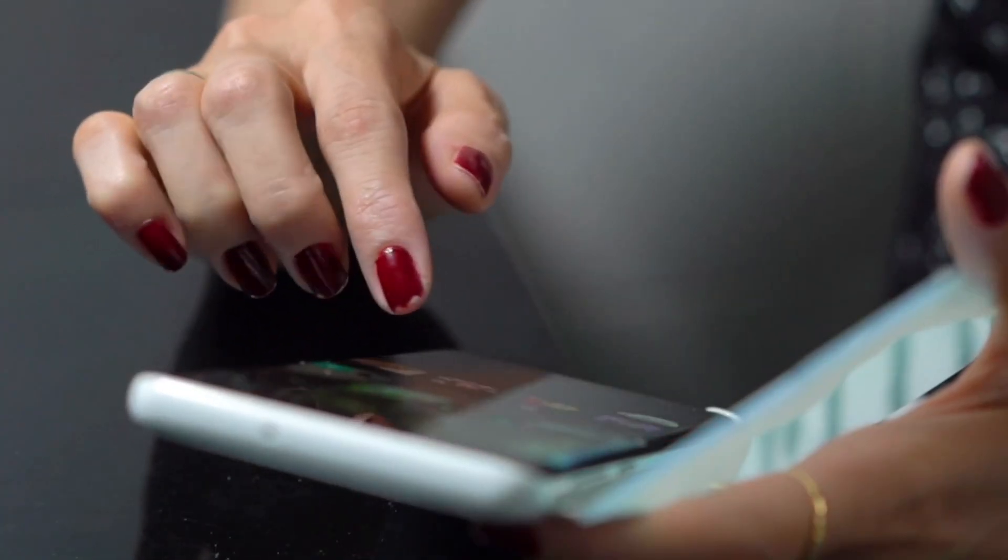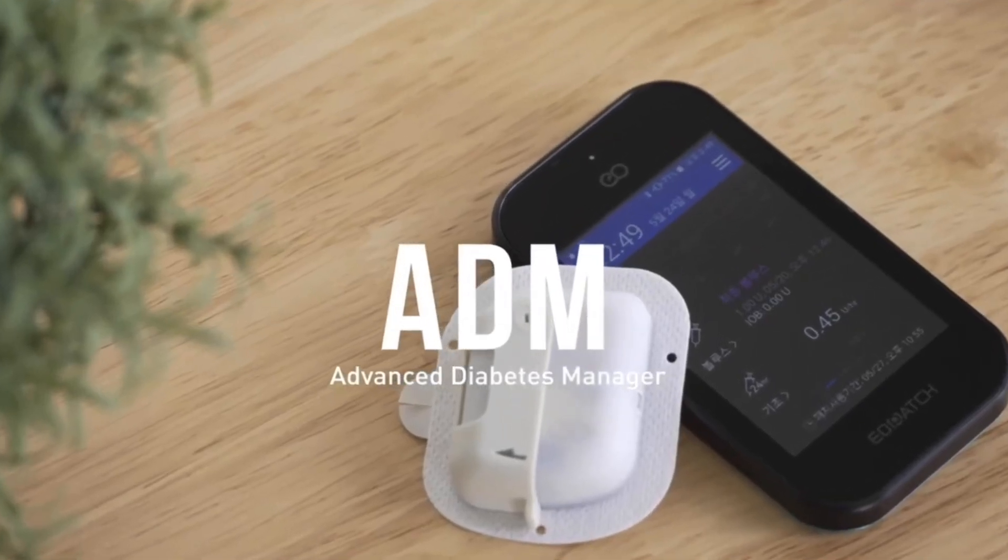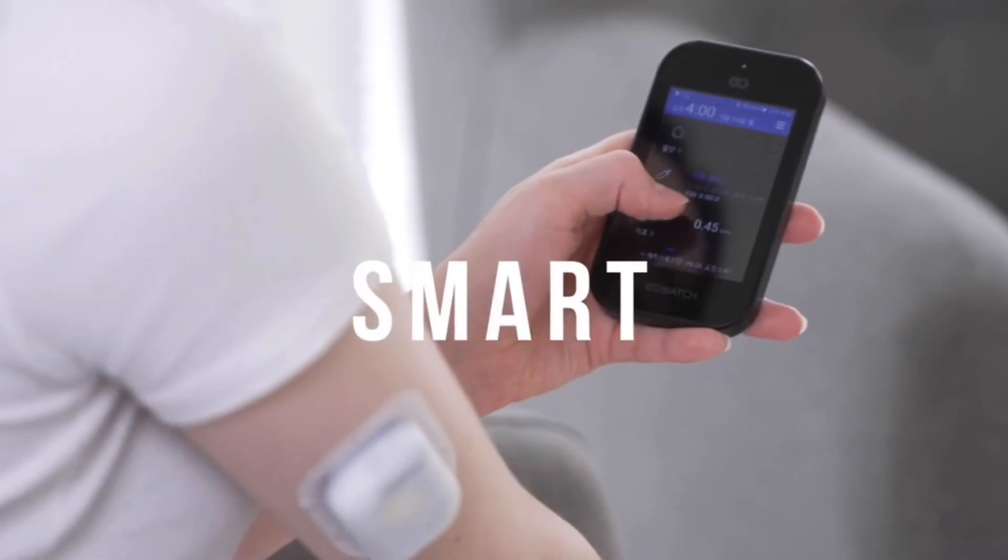And as great as the Omnipod 5 is, it's always great to see some new competition in the market. Let's break down the details of this insulin pump, starting with the way you control and interact with the pump. You actually have two options. You can either use a dedicated pump controller, which is a small touchscreen smart remote, which they call the Advanced Diabetes Manager.